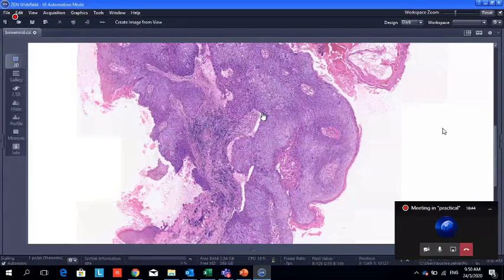Okay. Any question? Doctor, what's the difference between coilocyte and metastasis? No, metastasis is... I mean, in dysplasia, did the dysplasia metastasize?